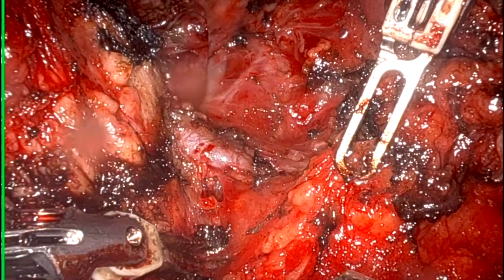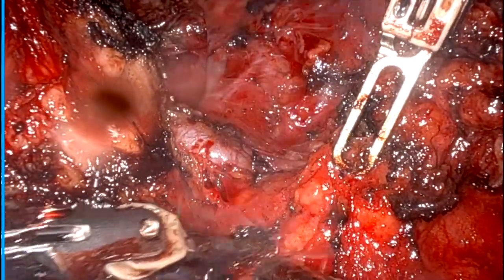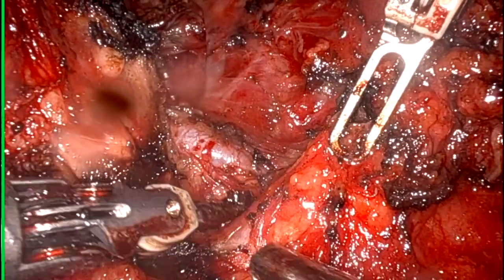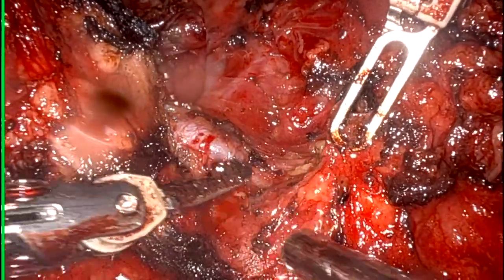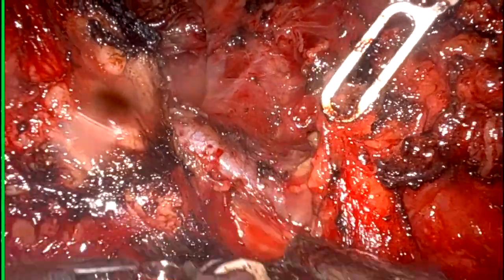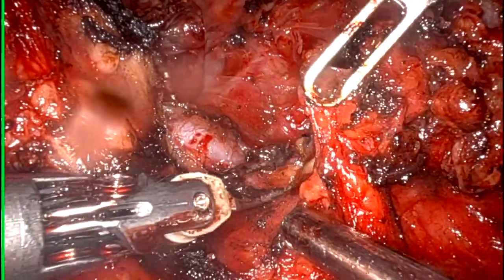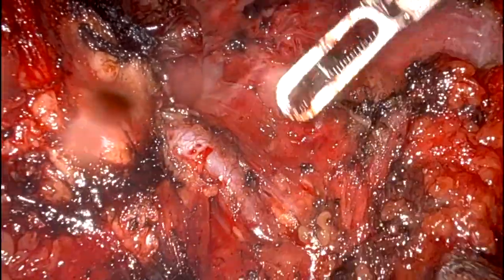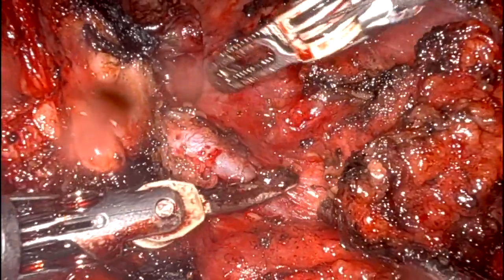There might be a node here. Maybe reactive. Dissecting the vein a little more. And we have enough of lateral dissection. Let's go again medially.